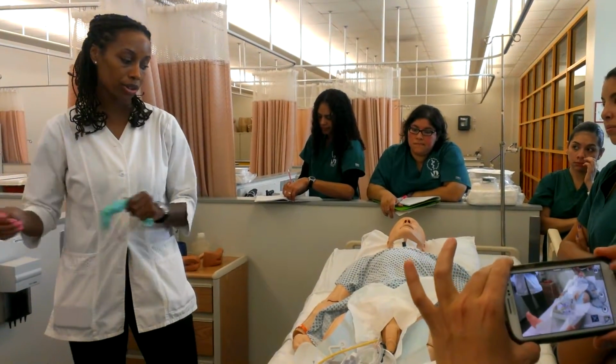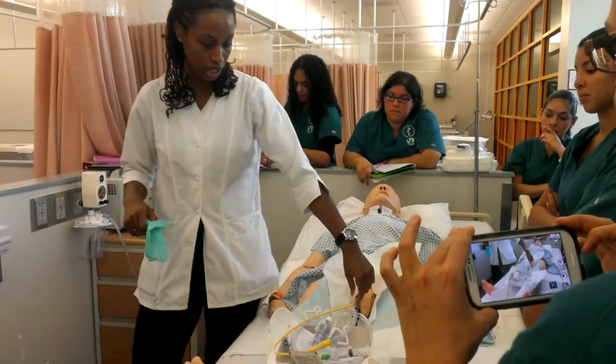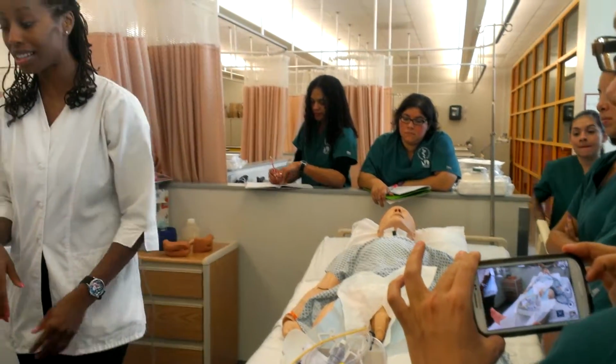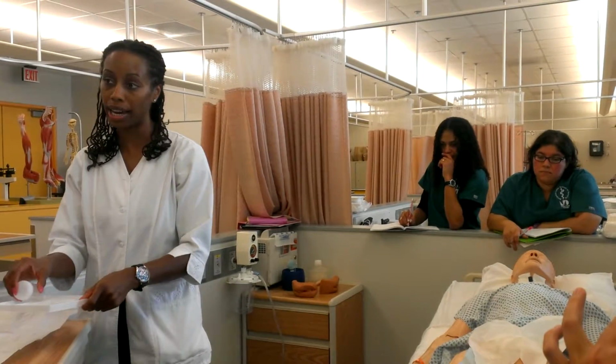And with the condom catheter, you have to leave room at the tip, because if you put it on all the way to the tip, then urine can't come out. So it's all in the technique that'll make or break the condom catheter.